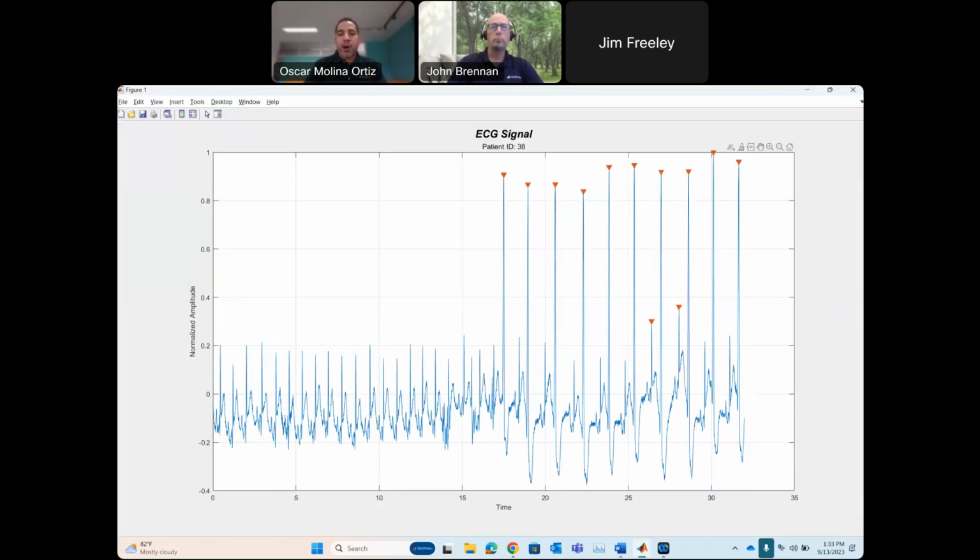So we look at the plot, and then maybe I did not mention this at the beginning, but part of the secret sauce of these algorithms is to read all of these peaks and do some sort of normalization in order to estimate the heart rate and the breath rate, right? But to do that, we need a minimum number of peaks in order for the calculation to be accurate. But then look at what happened here.